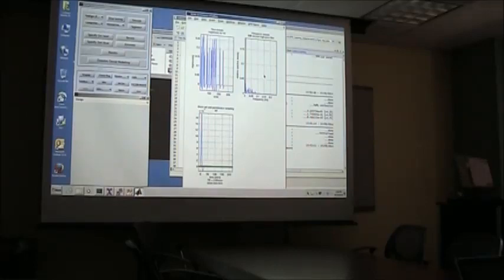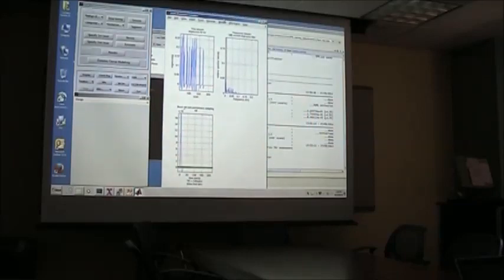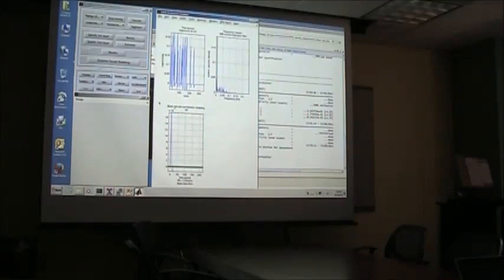But if you have a design, especially a block design, where your stimuli are not presented often enough or are too far spaced in time, this will become an issue. Again, this is something you'd rather take care of at the design level of your experiment than worry about at this point, although it happens sometimes. Okay.